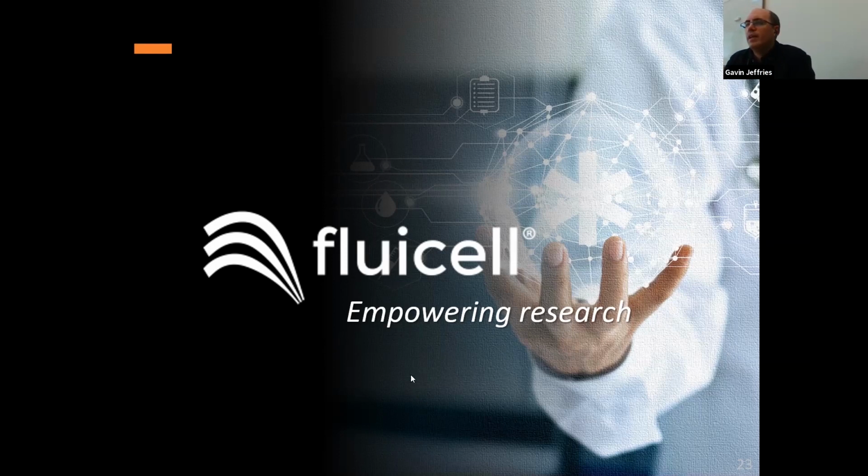Depending on the cell type, it changes, but essentially they are components of either ECM or media, like attachment proteins such as laminin or polyornithine or polylysine, and other kinds of adhesive, either amino acids or proteins. We vary it depending on the cell type, because each different cell type prefers a different adhesive agent.